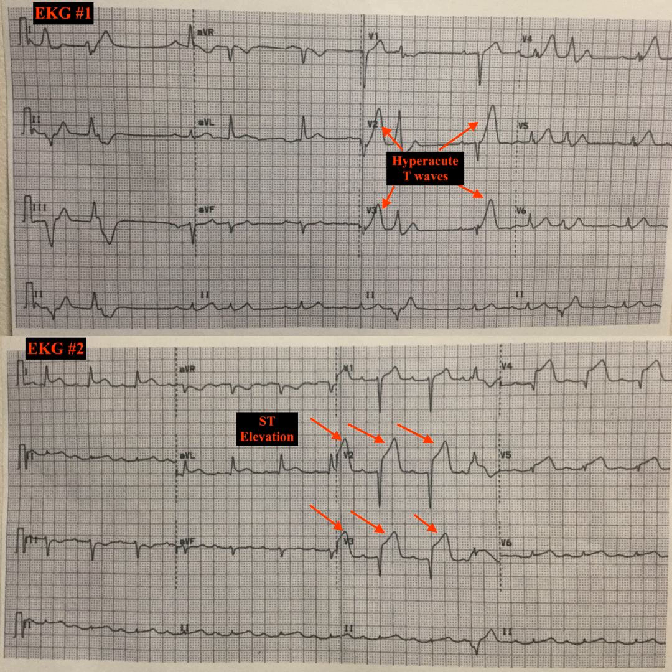So it ends up that this is what you see minutes after a STEMI, or what's going to eventually become a STEMI, and I have another EKG to illustrate that. It only is present for a few minutes in isolation, maybe 30 minutes to an hour. And then the next thing that you see is ST elevation. ST elevations can come on within generally an hour and then persist for up to how long? What do you think? 24 hours. Yeah, you'd think it'd be just hours, but it can be up to several days.